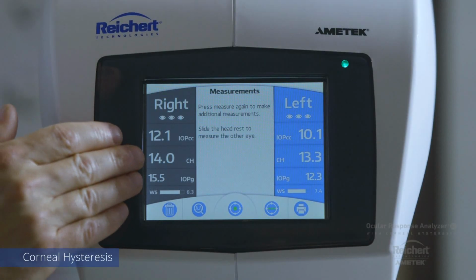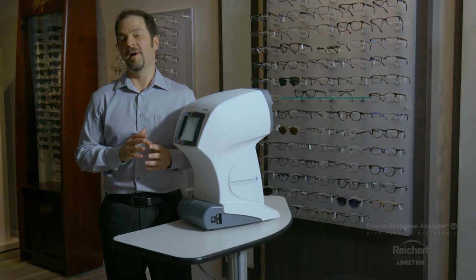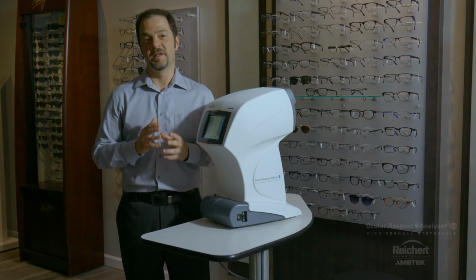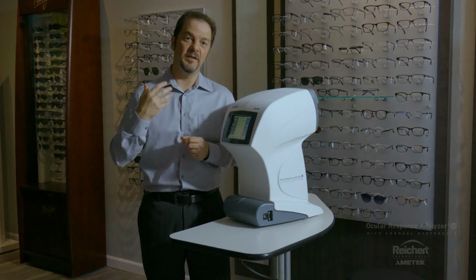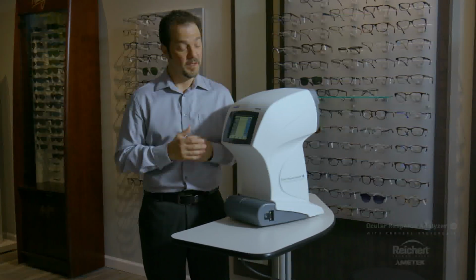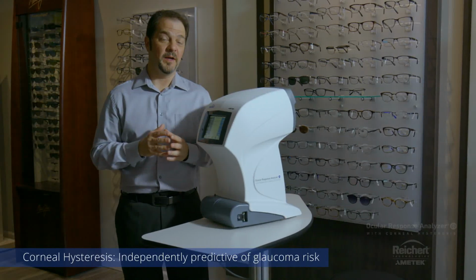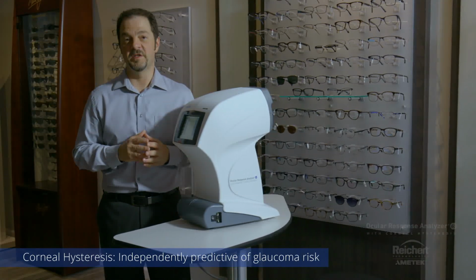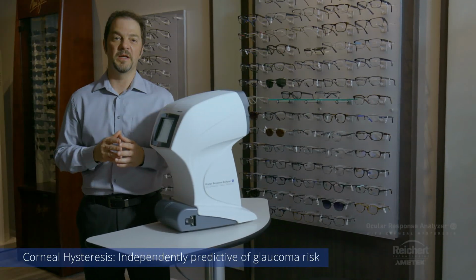Now let's look in the middle here at corneal hysteresis, CH. Perhaps the most important number on the screen. Corneal hysteresis is an indication of the biomechanical properties of the cornea. It's related to the viscoelasticity of the cornea, and since the eyeball is connective tissue, this corneal measurement is reflective of the condition of the back of the eye. It's been shown that corneal hysteresis is related to optic nerve changes in the back of the eye that are consistent with development or progression of glaucoma, and it's been shown that the corneal hysteresis measurement is independently predictive of future rate of visual field progression in glaucoma.